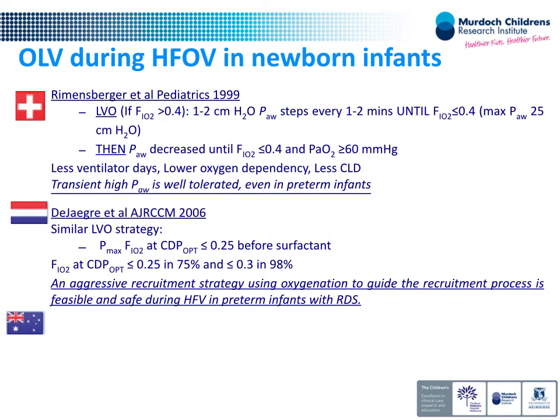And do you see how this is a recurrent theme, isn't it? Sorry? Surfactant or ventilation? In terms of lung injury, well, both are, I think, lung protective strategies. Now you're talking about should you do one before the other, or maybe at the same time, and this depends on, like I said, if you are a prophylactic surfactant treatment center, then the surfactant is already in there at the time the baby fails.